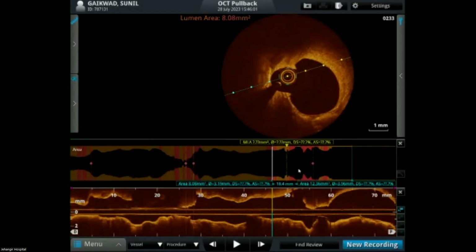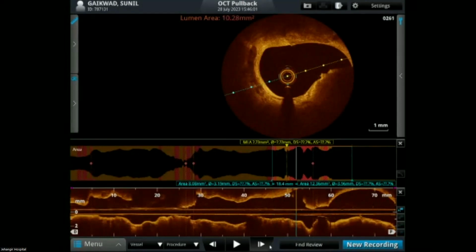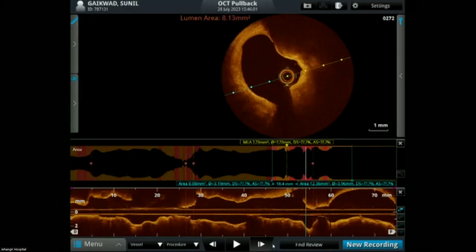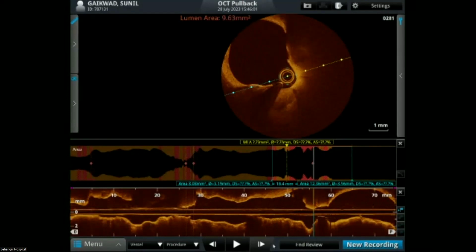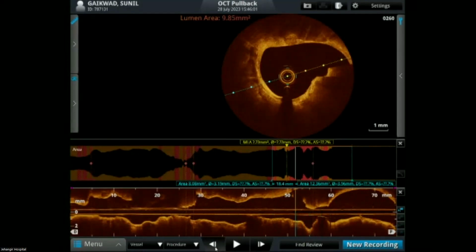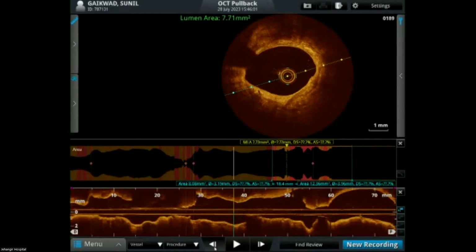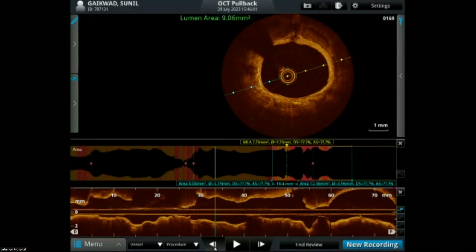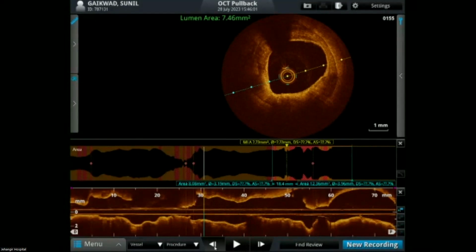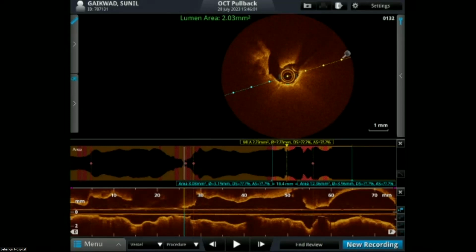So the question from our panel is, how comfortable are you in general with rotational atherectomy in the setting of an acute MI? No, but when you are pushed to the wall and we have such heavy calcium and we cannot deliver, see, there is a lot of data from South Korea on rotational atherectomy in acute MI, and compared to non-acute MI situations, the results are good. So that was the only thing. Otherwise, we will not be able to do anything to the lesion.